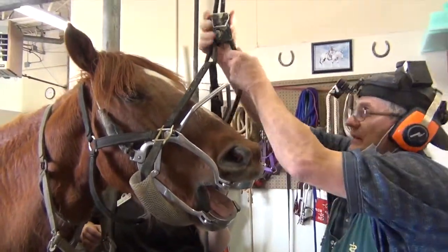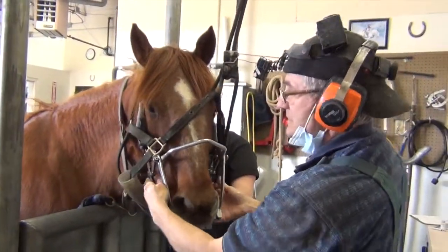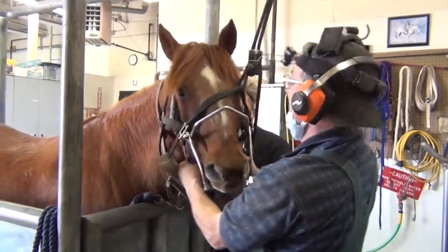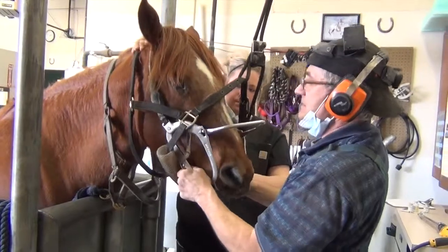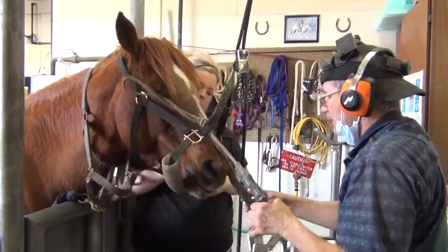So we're going to just take the speculum off. And you can see she's not all that sleepy, and she's being very cooperative. Other than the one time I scared her. I'm going to take the mouth speculum off, and we're going to glance and take a look at her incisor teeth and make sure that they look healthy.